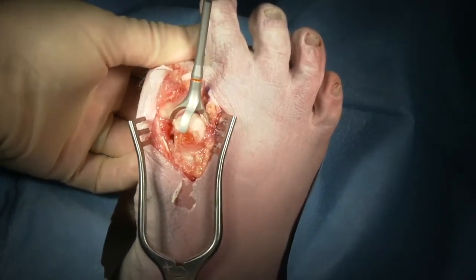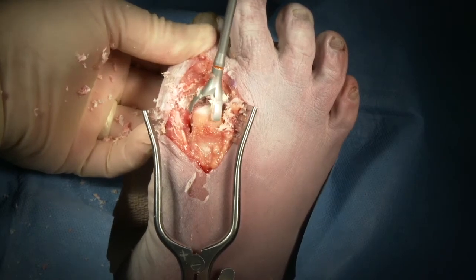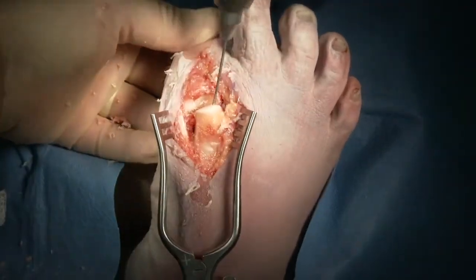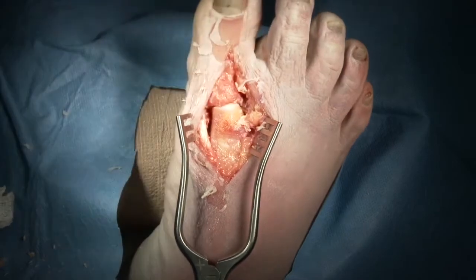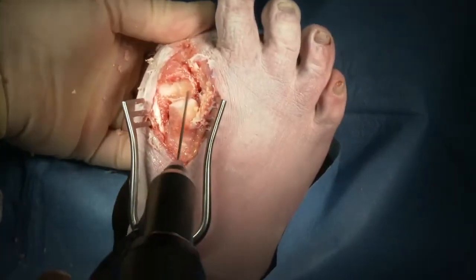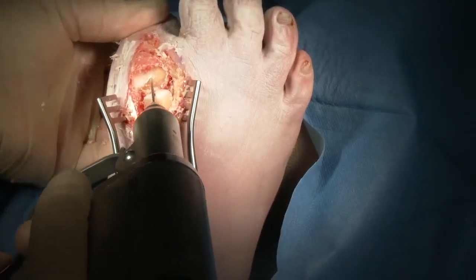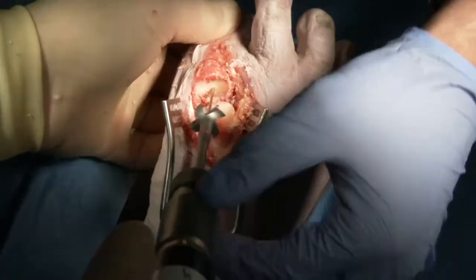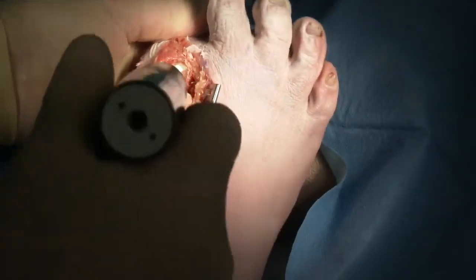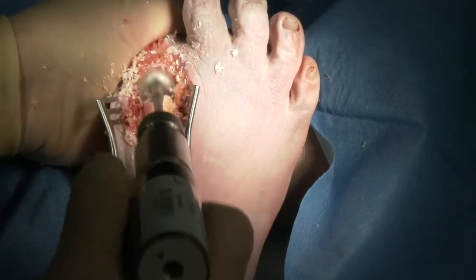We then take our reamer and remove the distal cortical bone down to the level of cancellous bone so that we can get the proper shape of the joint. Once the reaming is completed, we'll take out our guide wire from the metatarsal, then plantar flex the toe and introduce the guide pin into the proximal phalanx. We will ream over that guide wire to create a symmetric surface on the opposite side of the joint, completing the reaming by removing the subchondral bone down to the level of cancellous bone.